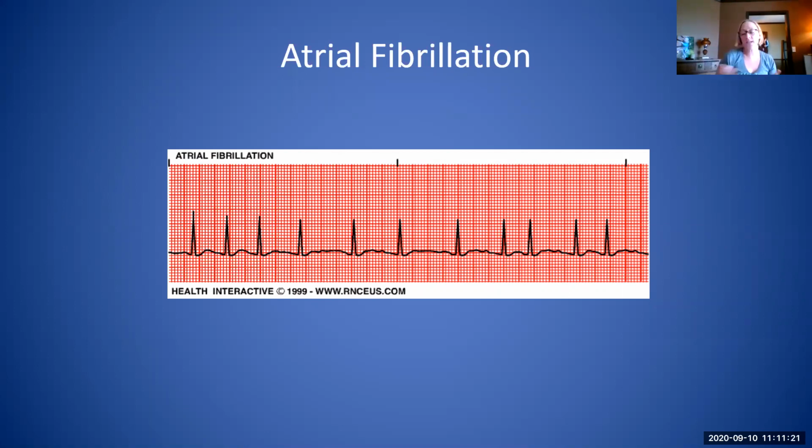So oftentimes atrial fibrillation does have a rapid ventricular response, or RVR. You might hear it called AFib with RVR. That's a rapid ventricular response, meaning enough of those impulses are getting through to the ventricles, causing a rapid heart rate. But it's not regular, so just randomly some are coming through. It's never going to be a regular rhythm. It's always going to be irregular with atrial fibrillation. Since the atria just quiver and don't contract, what is it that our AFib patients are at high risk for?